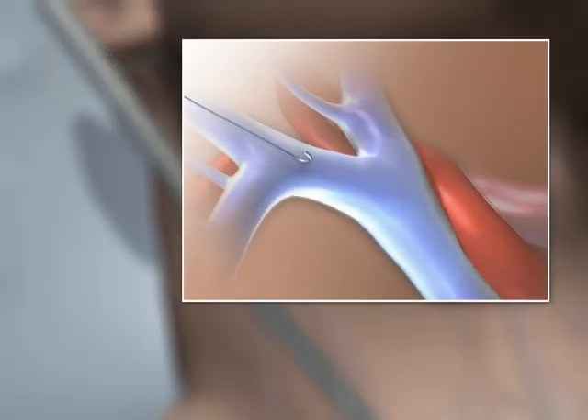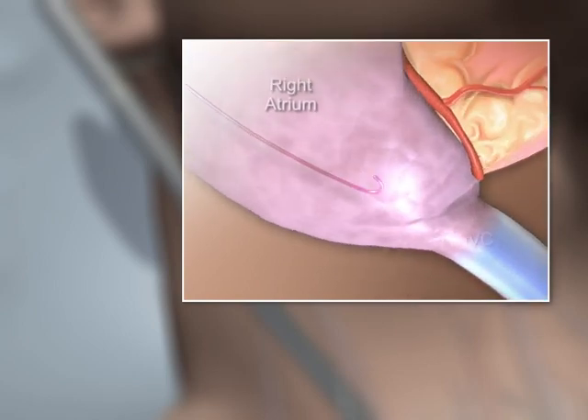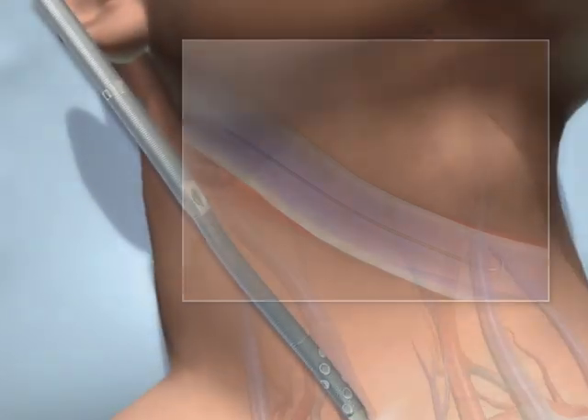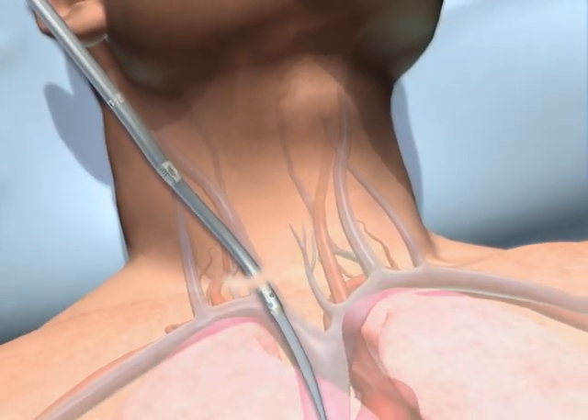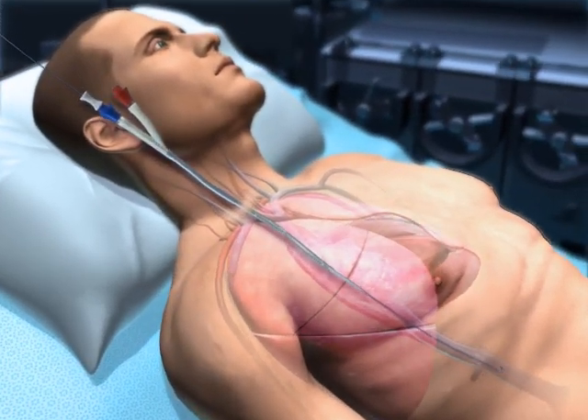The Bicavel DLC is inserted over a pre-positioned guide wire through the right internal jugular vein. Both the guide wire and catheter must be placed using continuous image guidance to assure proper placement and reduce risk of complication.